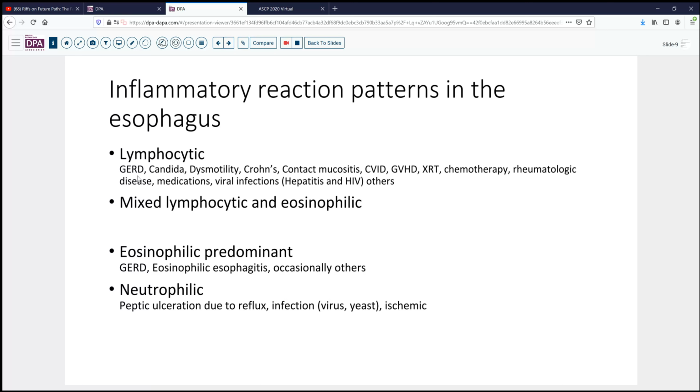We like there to be several fragments sampled to help us in our evaluation, because as you can see here, there's very, very few eosinophils. Here's a couple over here, but nothing close to that threshold, and yet this is the same disorder, eosinophilic esophagitis. And here we see more eosinophils. Again, you can see the variability from area to area. So sampling is an important limitation to making this diagnosis.